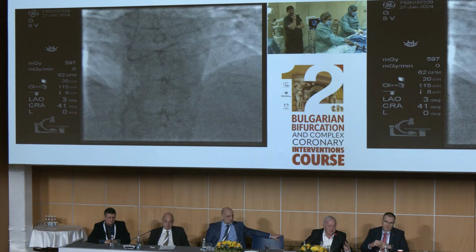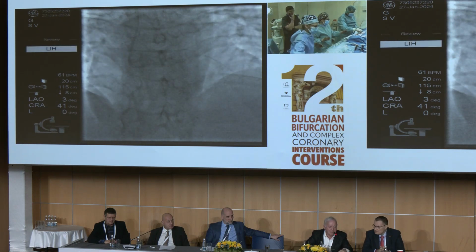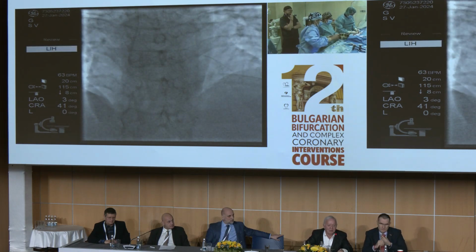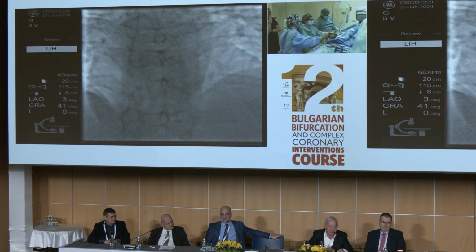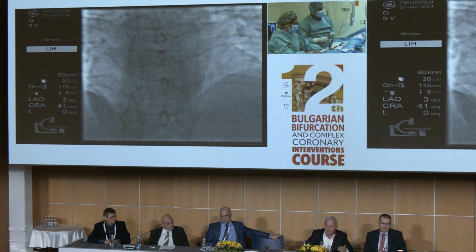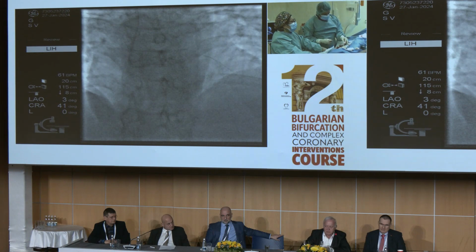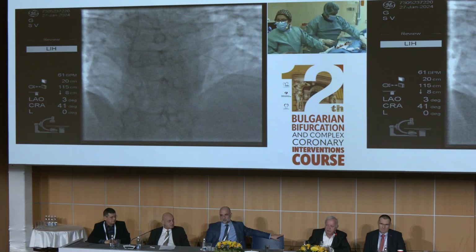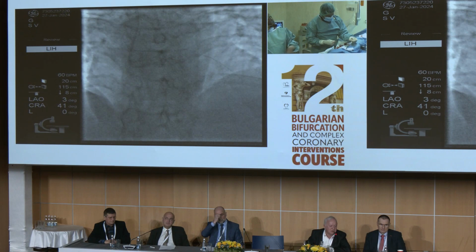Yeah, of course. Do you have stent enhancement in your cath lab? This is also part of the evaluation of the result when you are not able to buy IVUS or CT. We're not poor in France, but these are not reimbursed. If you are doing 2,600 PCI a year, and probably more now, it represents a big budget. I know from data that in Europe, intravascular imaging is used in 5% of procedures, no more.